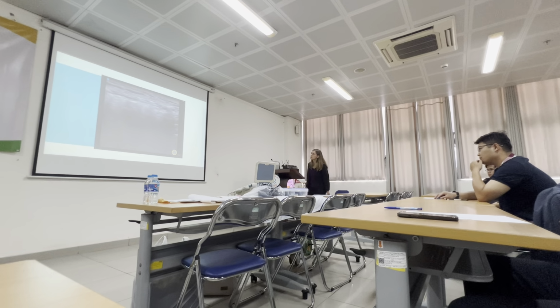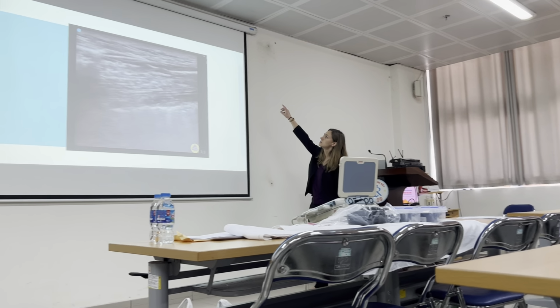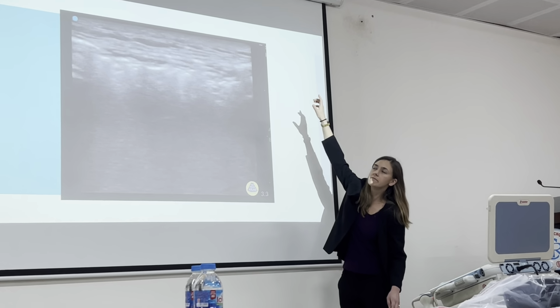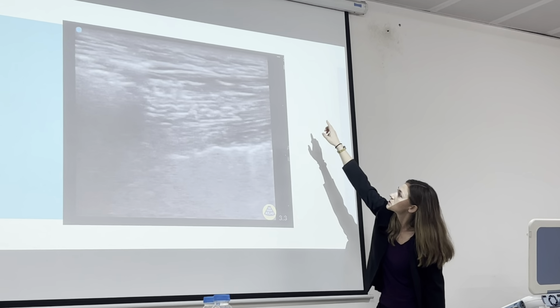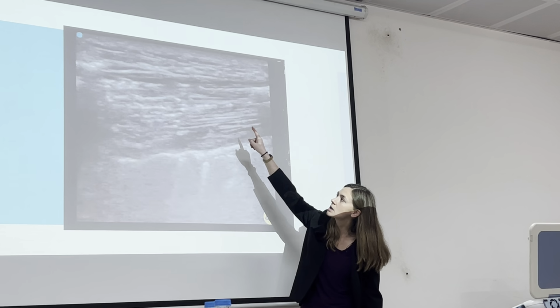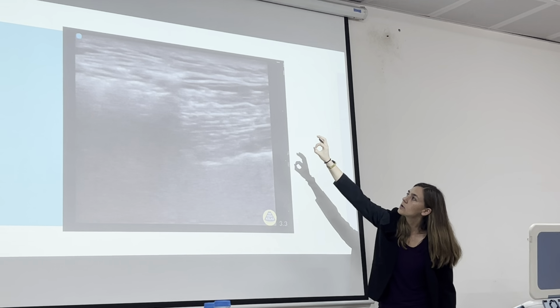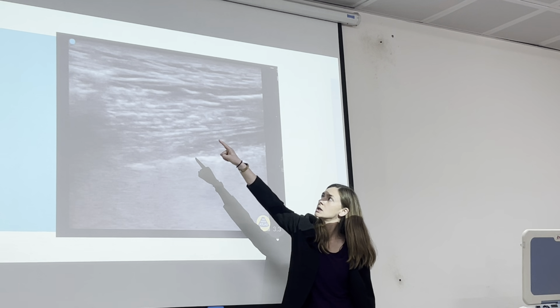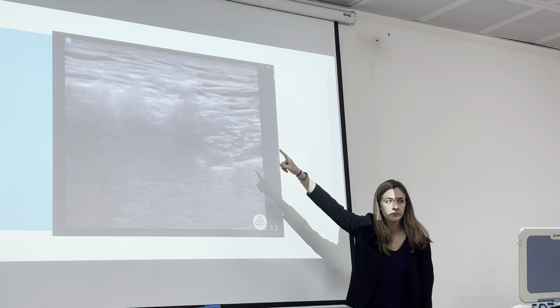We'll look at this from the top down. I see some thickening of the epidermal layer. Unfortunately, it's very short. I agree with you that as we get towards here, we start to see some cobblestoning, but we'll talk about that in a minute. I'm not quite seeing those fat lobules. To me, this fluid here looks kind of linear.